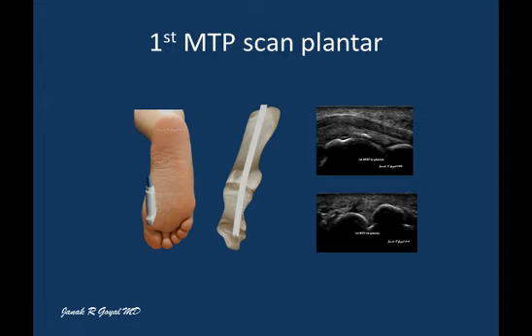Examine the plantar aspect of the MTP joint along both long and short axis for any subcutaneous pathology, and examine the flexor tendon and the plantar aspect of the MTP joint for any abnormalities.